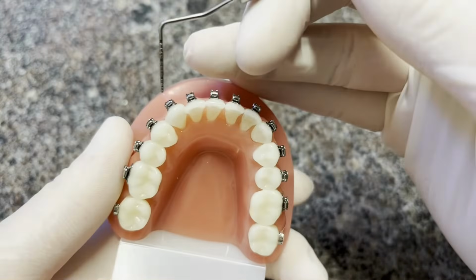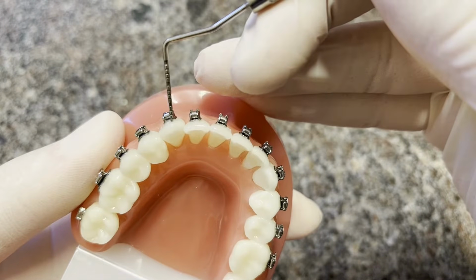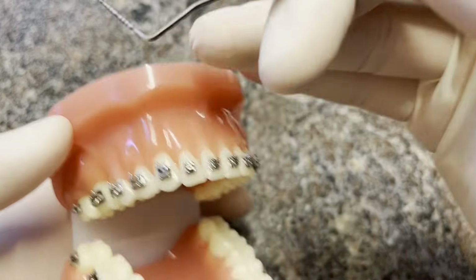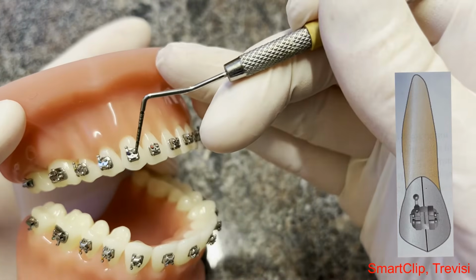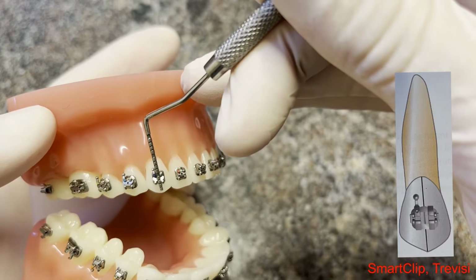On the lower 3s, you'll set them just slightly to the mesial of the height of contour. This one's not too shabby as far as rotation goes, and parallel to the long axis. This one is tipped to exaggerate like this. You would want it parallel to that long axis, which would be right about there.